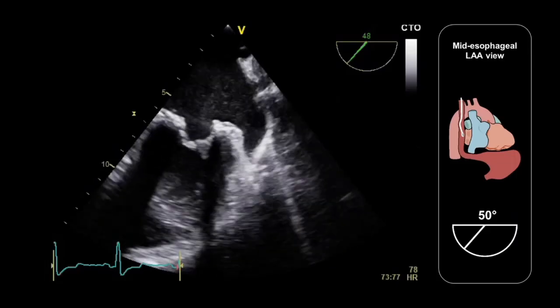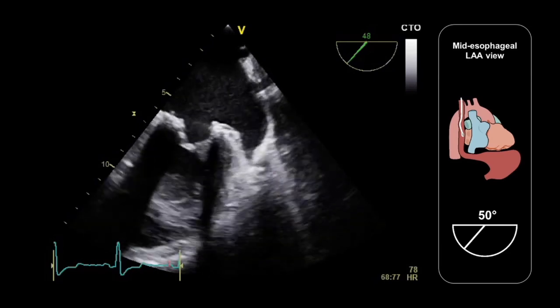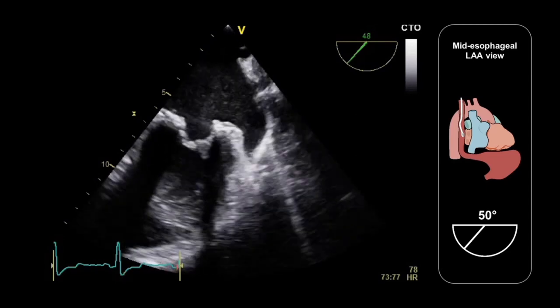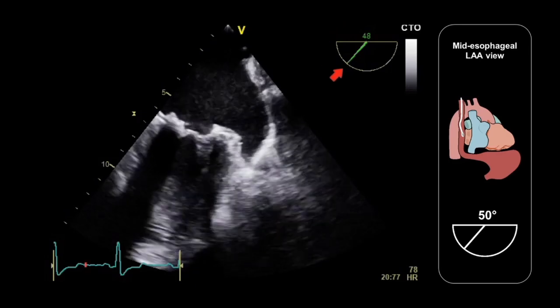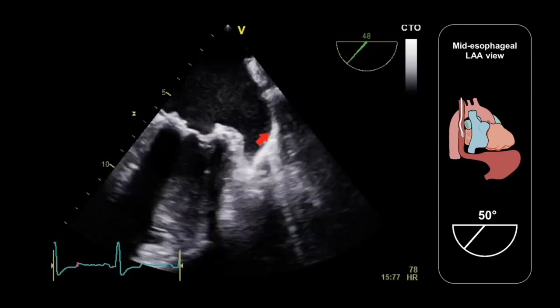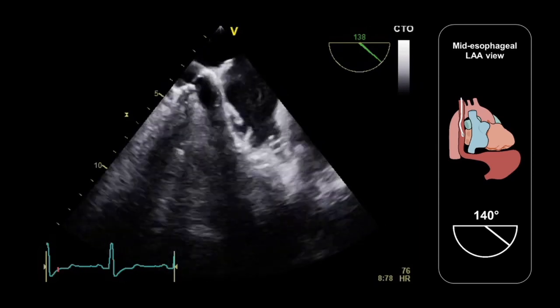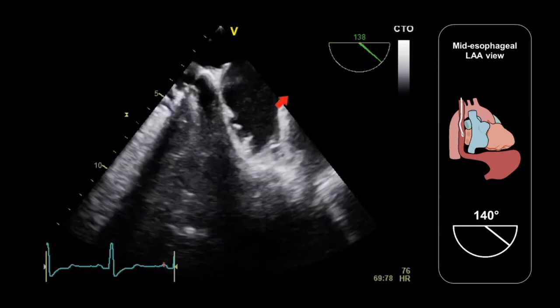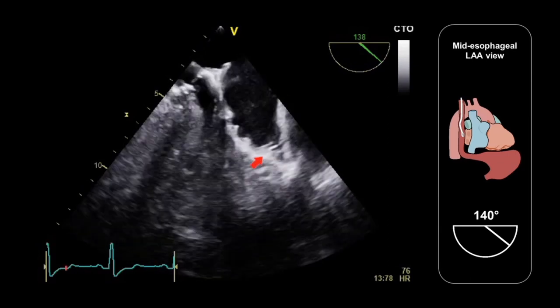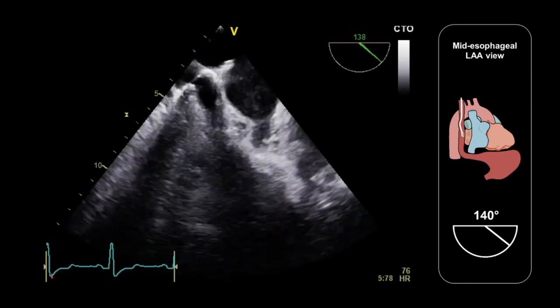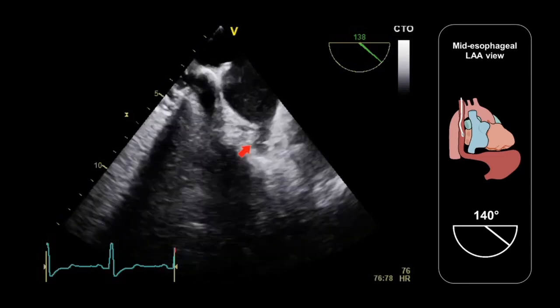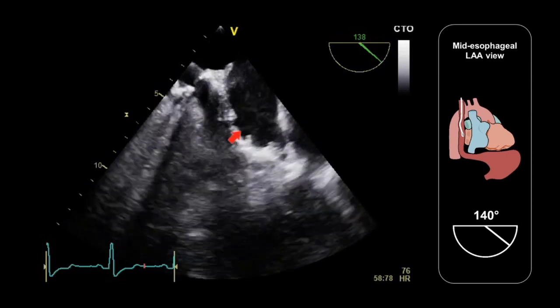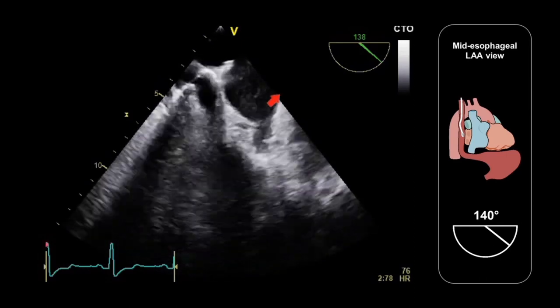When we assess the left atrial appendage in multiple views, we should aim to obtain at least two orthogonal views — in other words, two views at approximately 90 degrees to each other. Here's one view obtained at 48 degrees which clearly shows the left atrial appendage, and here's the orthogonal view obtained at 138 degrees showing the same appendage. In this second view we can very clearly see the pectinate muscles along the edge of the appendage — again, be careful not to mistake these for thrombus.